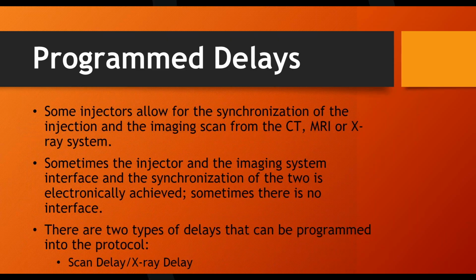So an inject delay, that's the same for all 3 types. CT, MR, angio injectors, they're all called inject delays.